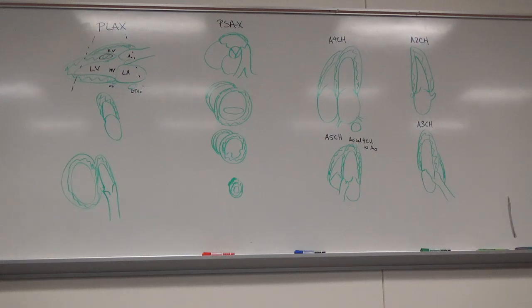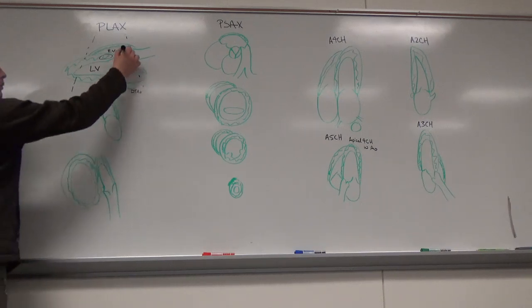Good, so let's go to the aortic valve then on the parasternal long axis view. So we've got 3 cusps. From your reading, what do you know that we see from parasternal long axis? Or even guess? Right. Okay, so we have 3 cusps: the right coronary cusp, the left coronary cusp, and the non-coronary cusp. Why do they call it a coronary cusp? Because a coronary artery comes out behind it in the sinus of Valsalva. The sinus of Valsalva is kind of the outpouching after the valve, and that's where the ostia, or the openings of the coronary arteries, are.